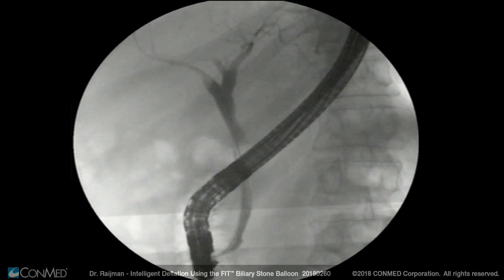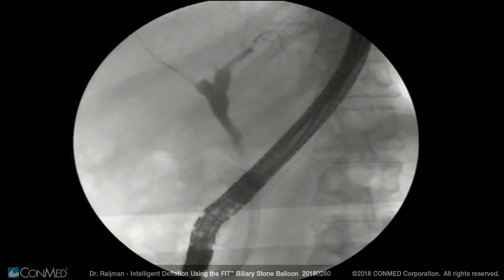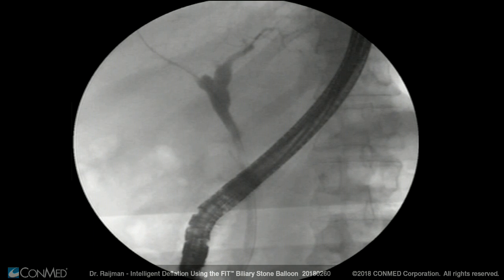The beauty of this technique is that I accomplished sweeping the duct and identifying the anastomosis without causing any trauma, while also preserving the integrity of the balloon and the cannula.